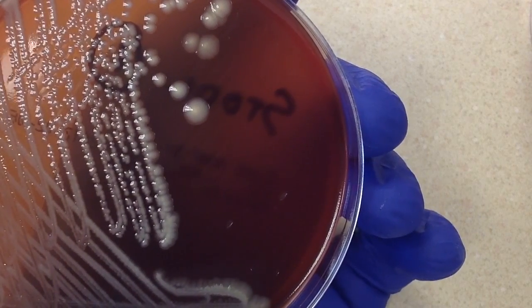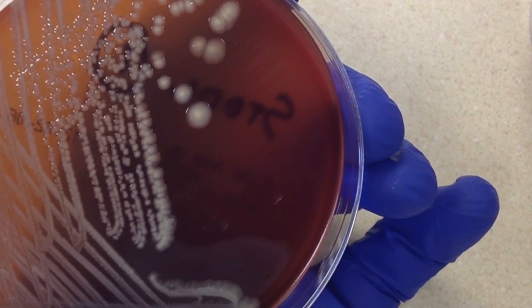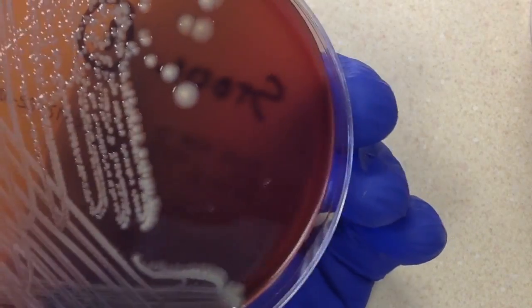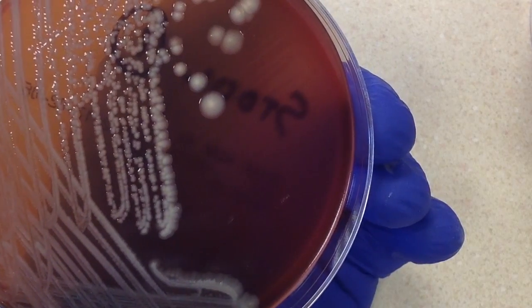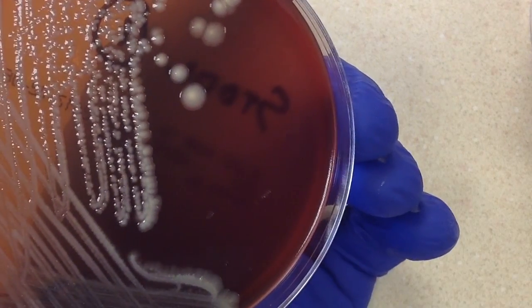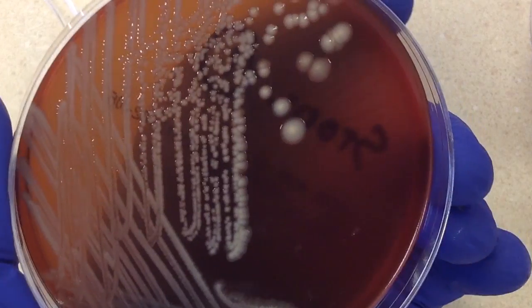But what am I looking for on the sheep blood plate? Staph aureus, which would probably more than likely be a little bit beta hemolytic. This culture is two days old, it's been incubating for 48 hours. Yeast have a definitely recognizable look to them. Just looking at this plate, I don't see either of those. I see just a lot of mixed bacteria here, probably gram-negative rods. I don't see anything here on the sheep blood plate that concerns me.